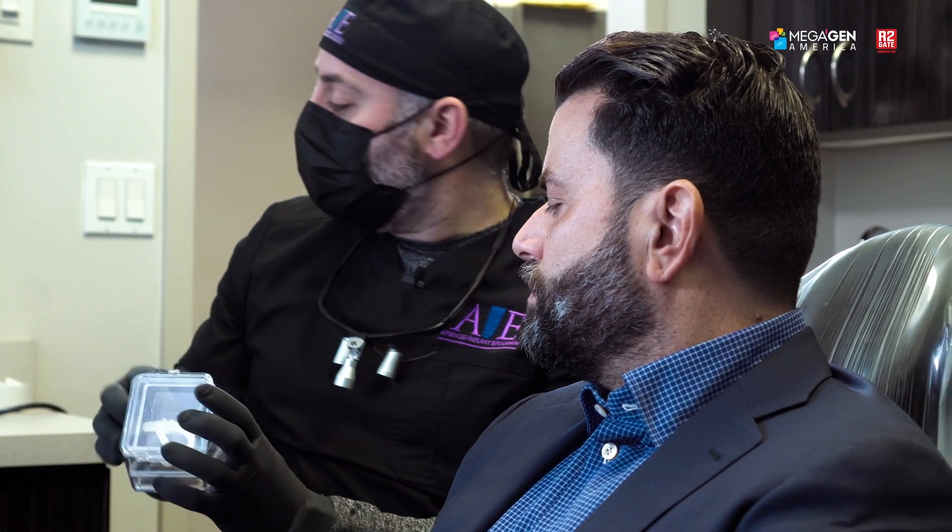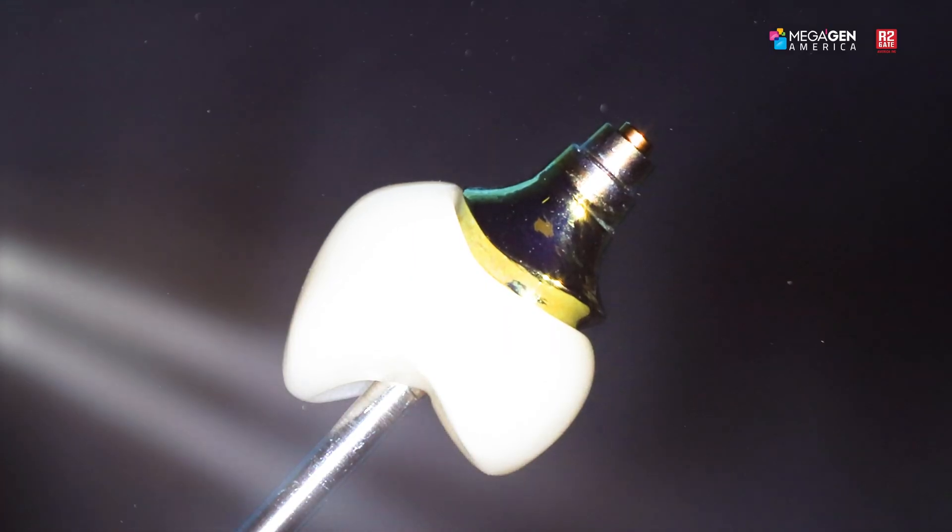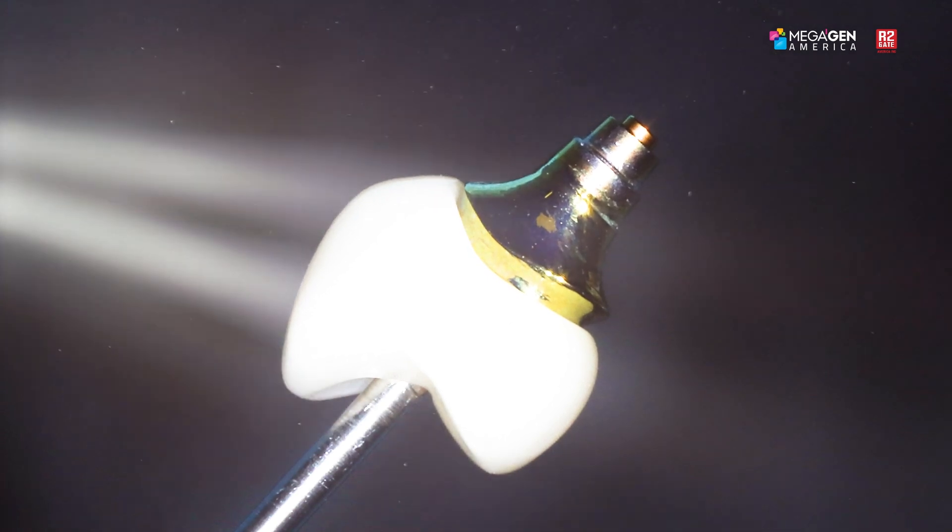Once we have our implant in place, I went ahead and made you a tooth. This is the post that's going to be coming out of the implant in the exact position we planned it, and a crown that's going to go right on top of it. So when we finish today, you're going to leave with a tooth already in your mouth.